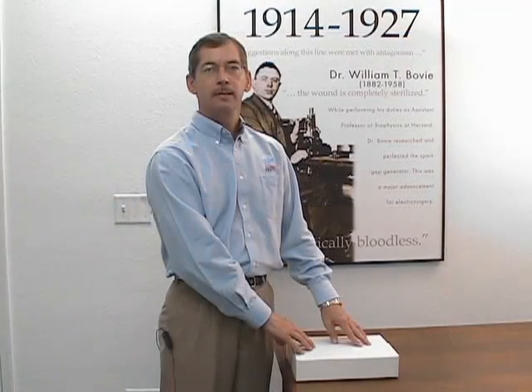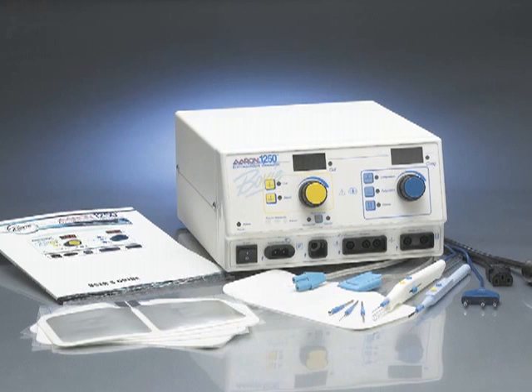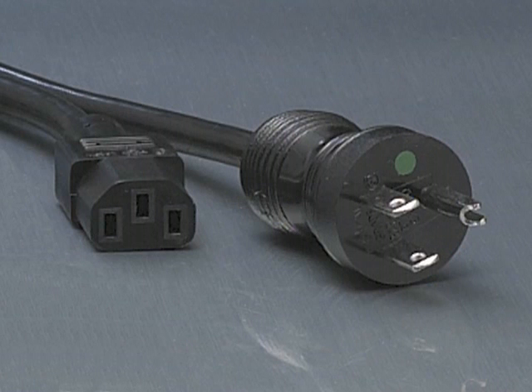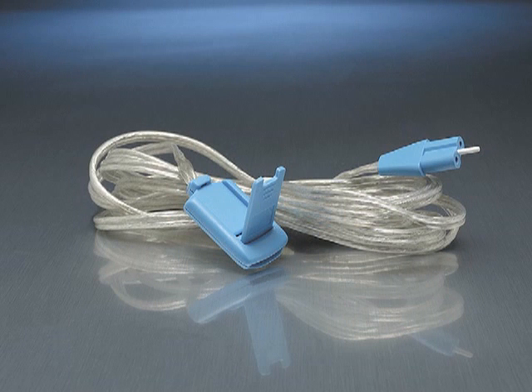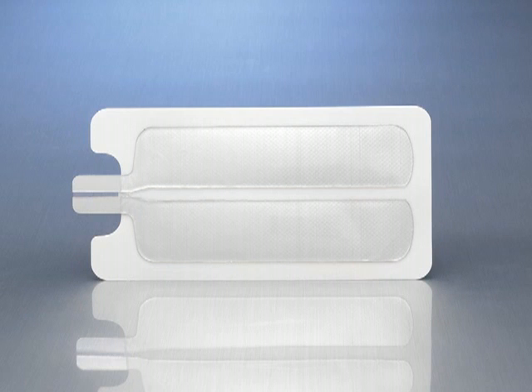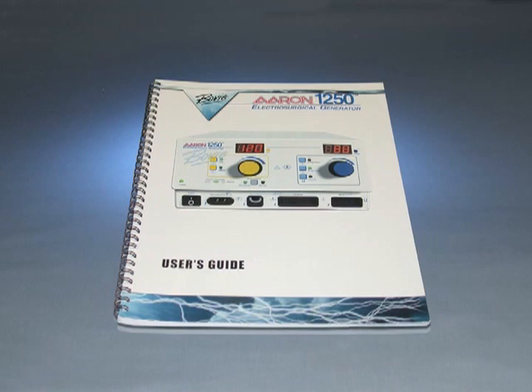As you open your accessory kit, verify the following items are present and check each piece for damage: hospital grade power cord, one sterile disposable pencil, one reusable grounding cord, five sterile disposable split grounding pads, three sterile disposable electrodes, one blade, one needle, one ball, and a user's guide.